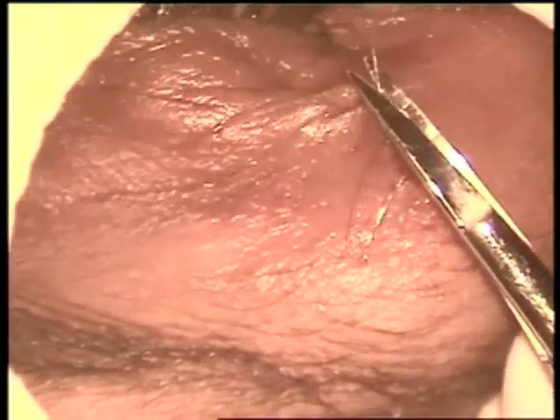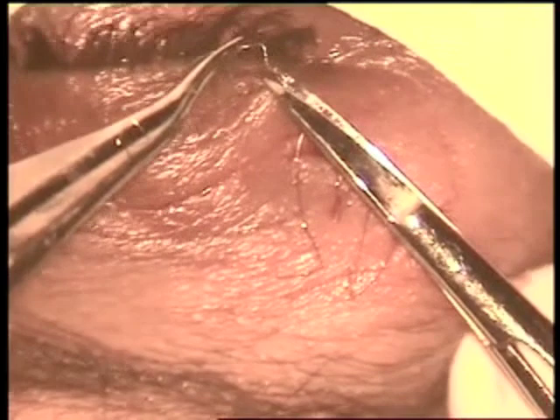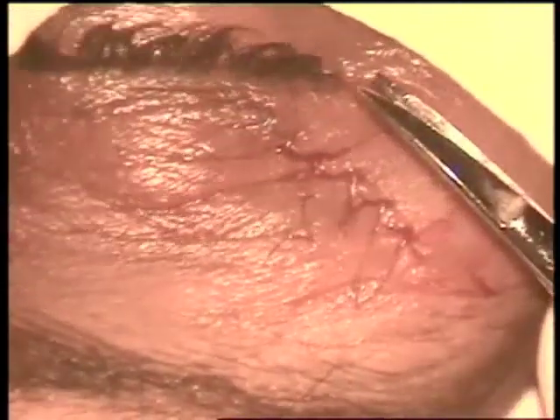The surgery takes only a few minutes, and this is followed by application of 18 micron steel sutures applied superficially to the skin. They don't cause any reaction and they fall off by themselves in a few weeks or months, causing no reaction at all. That finishes the surgery of orbicularis myotomy as developed by me.